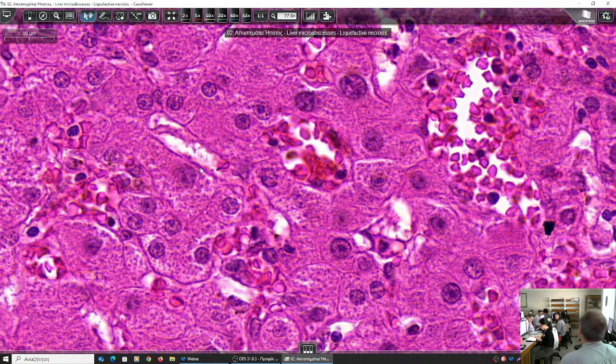Is it simple? Is it easy? Yes, it is. Is it a source of anxiety? No, of course not. It's just two things, to understand something practical. Okay? These are the microabscesses in the liver, and we discussed how they could be formed there. That's all. Next.